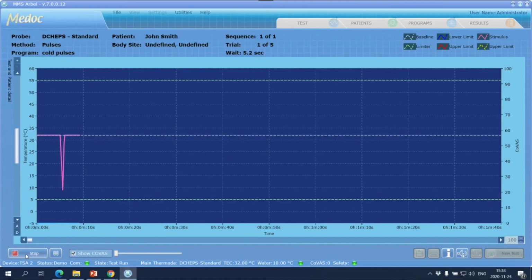And you can do nice evoked potentials, 40 degrees per second down and 70 degrees per second up. You can control the time between the stimulations. You can control the destination temperature, going to 10, to 7, to 9, etc.